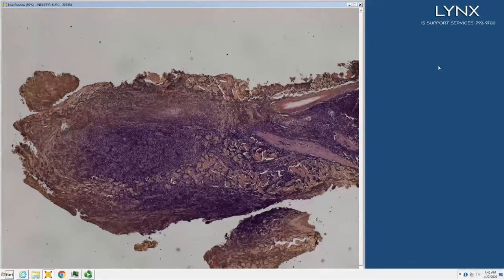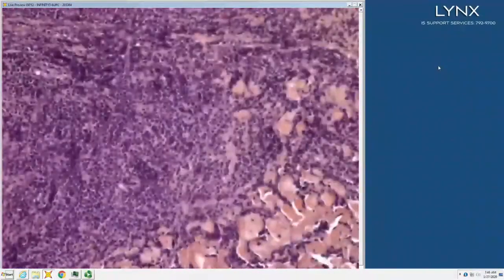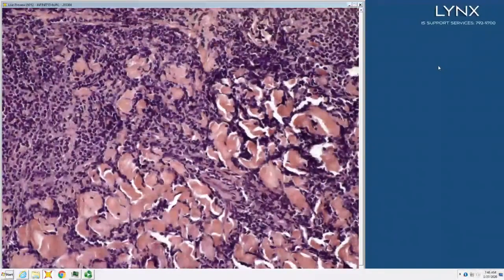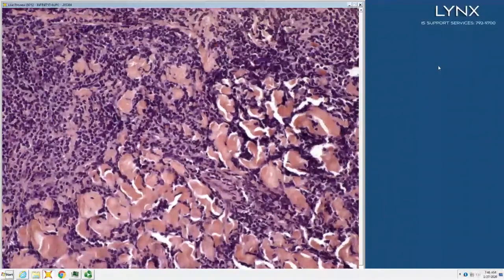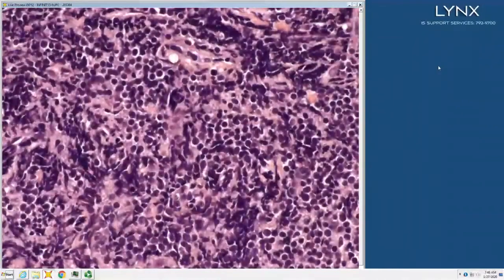That's a lymphoma pattern. And then your question would be T or B lymphoma. Well, CD3, CD20 will answer that question typically. In this case, it's CD20 positive, so it's a B. The cells are pretty round.